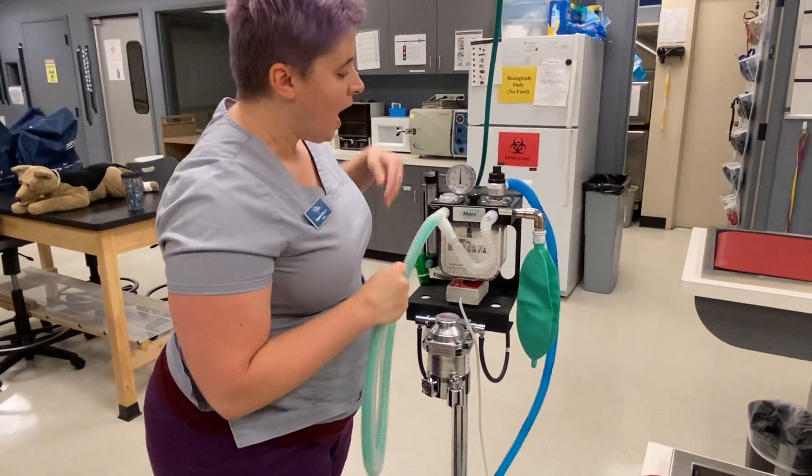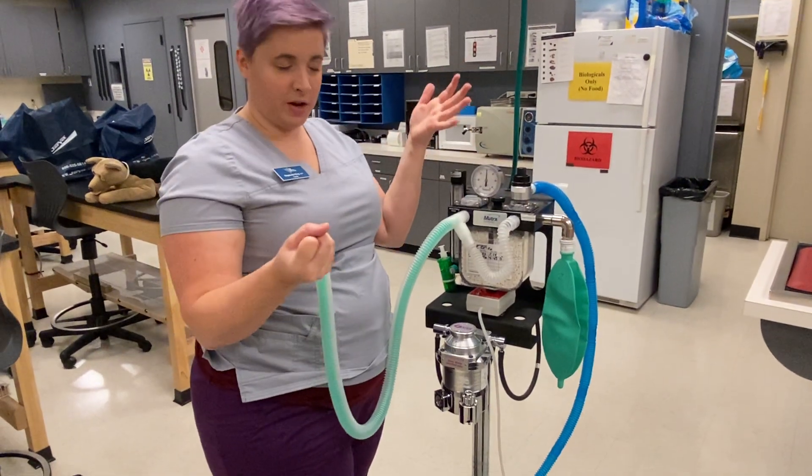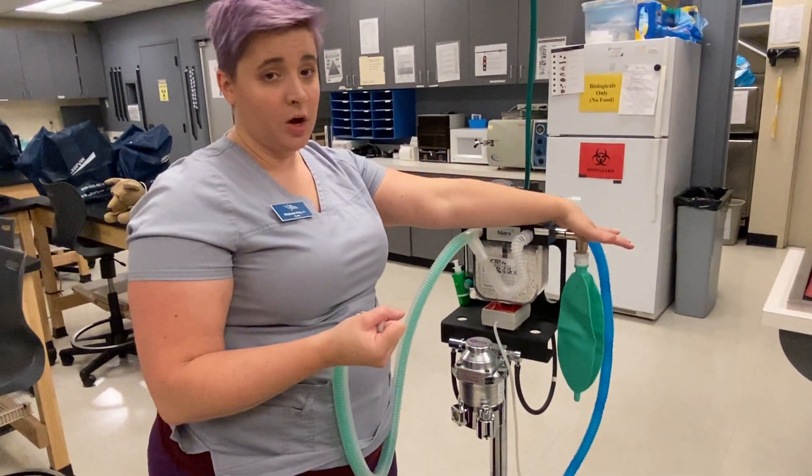All right, so now we're ready for our pressure check. I have removed the alarm off of the circuit so that it doesn't go off while we're videoing, but normally it would be going off.